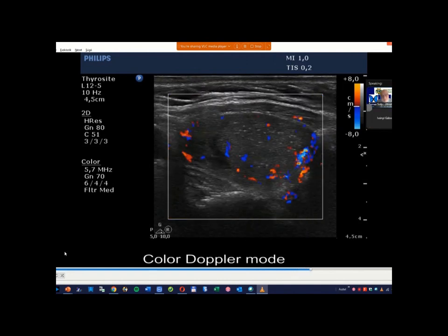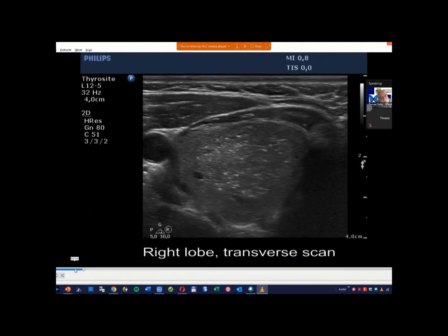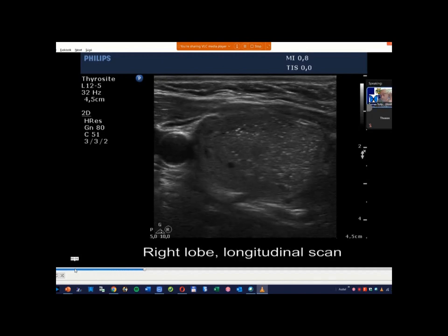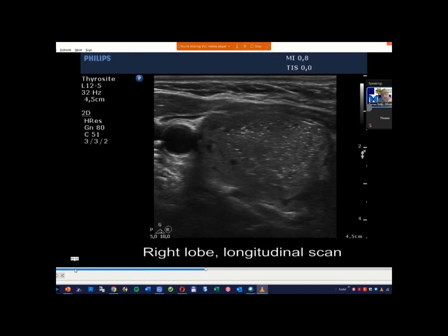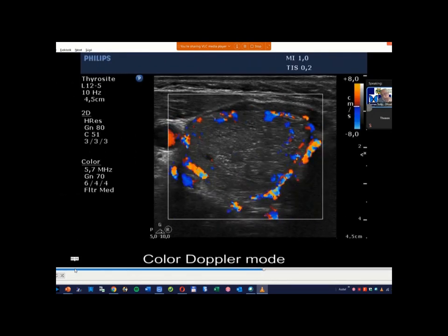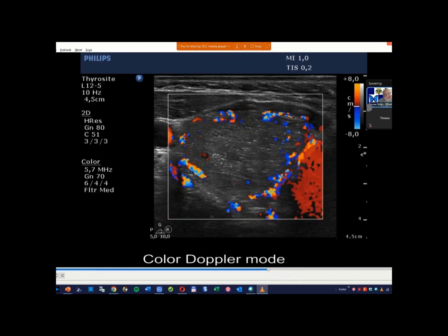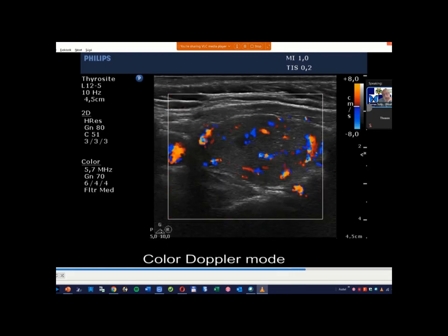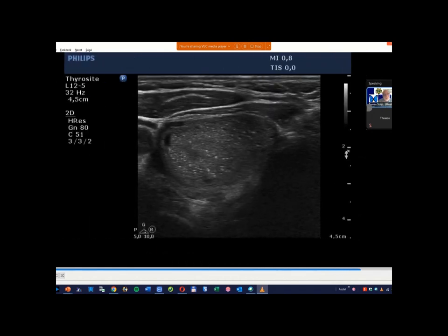Okay. Between follicular adenoma and carcinoma, in the ultrasound pattern, I don't think that we have any clue. The nodule had perinodular vascularity and was a solitary large nodule. This stands for follicular tumor, whether the benign or malignant counterpart. So this you never know. This vascular pattern clearly proves that this has a halo and is surrounded with a capsule, but no clue.